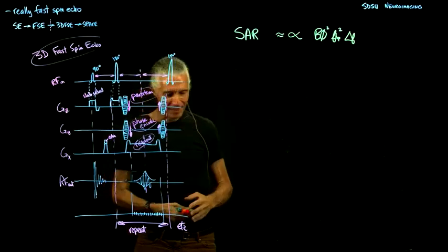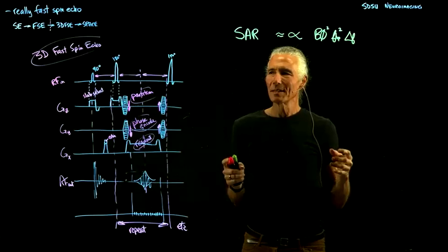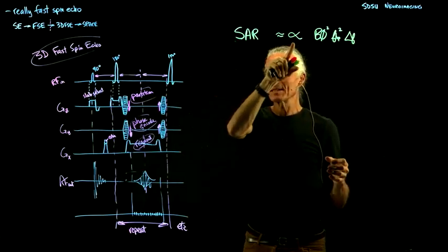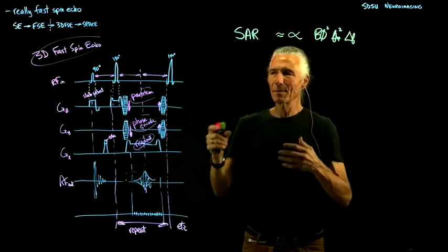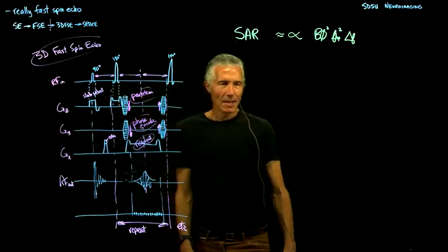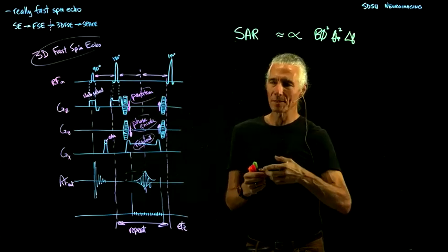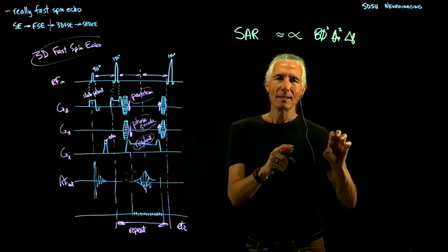And what is the problem? It's just not quite fast enough to get a whole volume of the brain, partly because of these RF limitations, because we can't go as fast as we could just in terms of the total amount of time, because then we would heat up the person too much. So, not only does the scanner, I'll just go back to the safety measures, not only does the scanner measure how much RF got absorbed, so it can tell how much it heated you, but it also has a model of how long it takes the heating to go away.